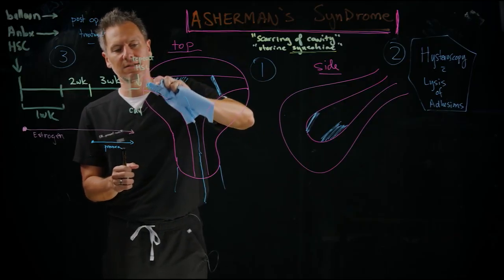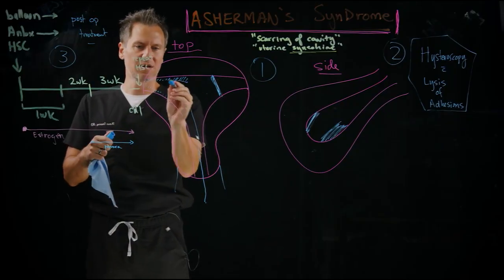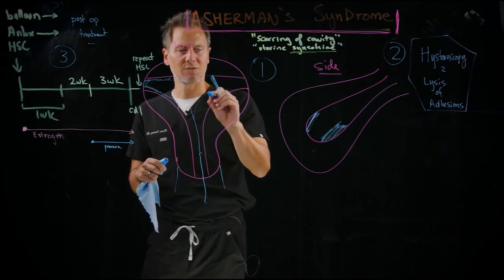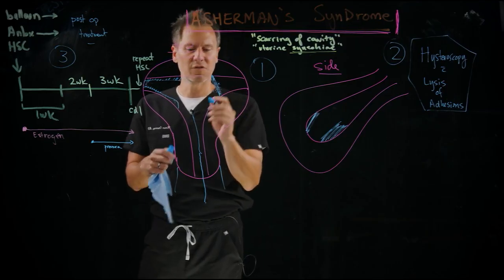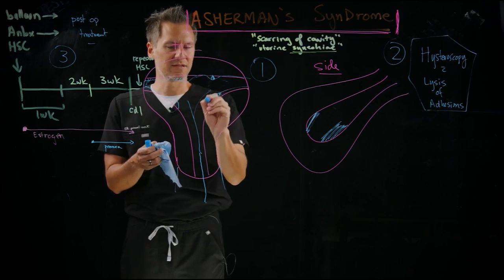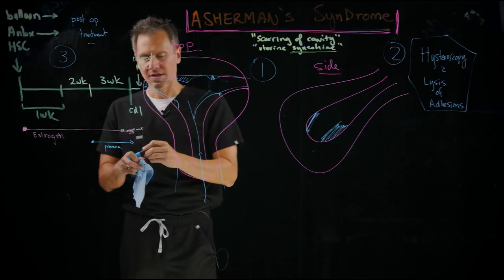looks like this. So where you have some remnant of the scar up here, but the cavity is opened back up, okay? In this scenario, we would go over, oh, there's scar on this left side. We would just cut this band, maybe remove a little bit of the scar, and then what's left is this. And now this person's cavity is normalized, okay? Whereas prior, this was completely obliterated. You couldn't see over here.